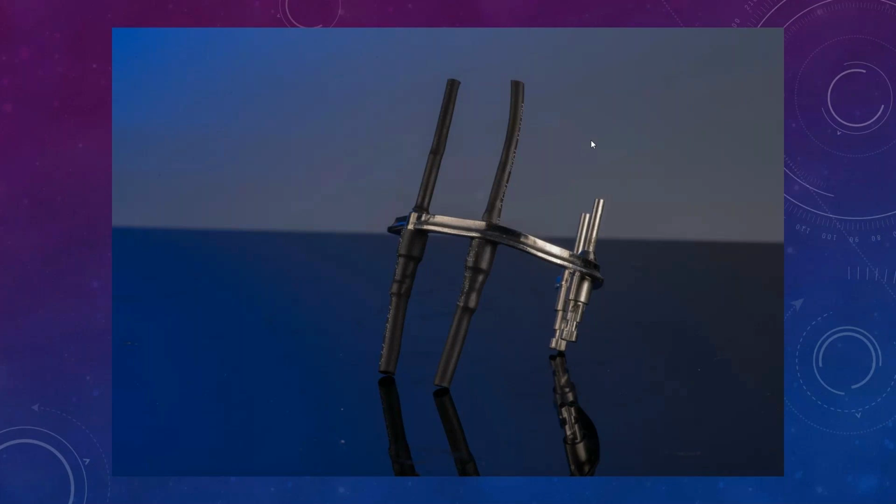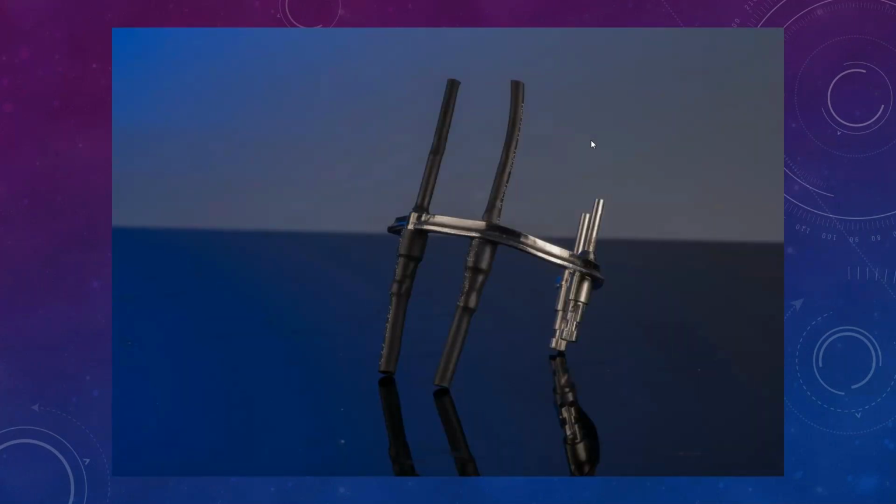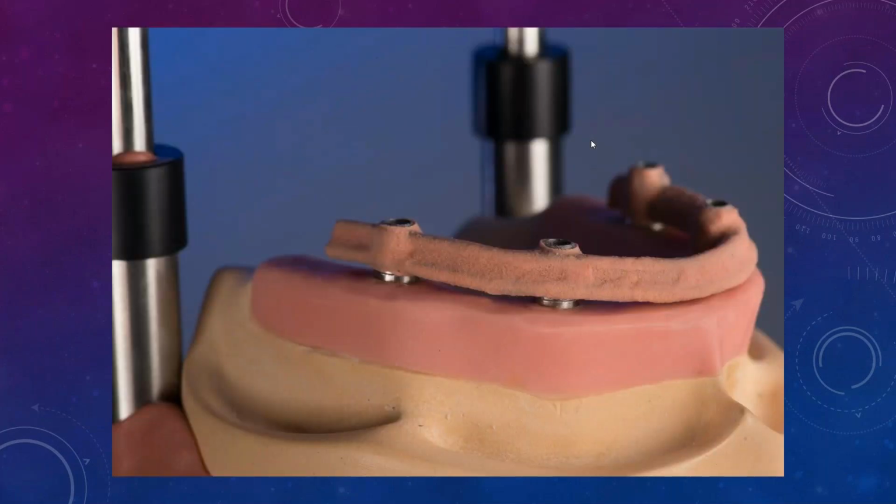The majority of my bars that are just regular like this, I design on my own in 3Shape. It's been a bit of a challenge in the beginning, but now I've got it all kind of dialed in. It works out pretty well for me. So basically what I'll do is I'll opaque the bars before we do the try-in. Here you can see I put some analogs in place, and I cover those analogs with some heat shrink that allows me to sandblast all the areas that I want to sandblast and leave the areas that I don't want to sandblast untouched. Okay, and then I'll opaque my bars.